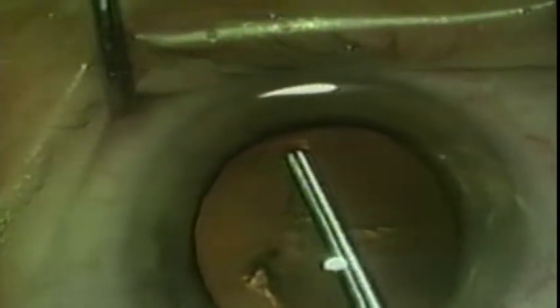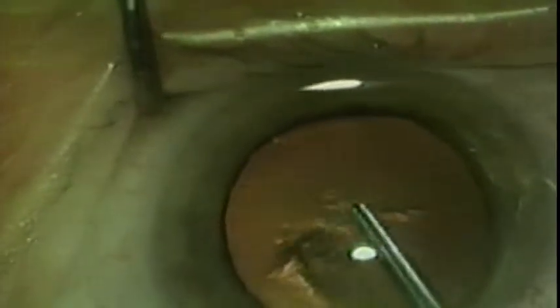This maneuver penetrates the capsule with the cystotome tip, thus opening it. Without releasing the capsule, the handle is rotated clockwise, directing the tear towards 7 o'clock. The capsule is then re-grasped close to the edge of the tear, and the forceps rotated counterclockwise, continuing in the direction of the tear towards its origin.